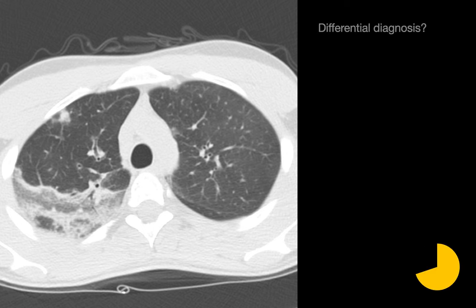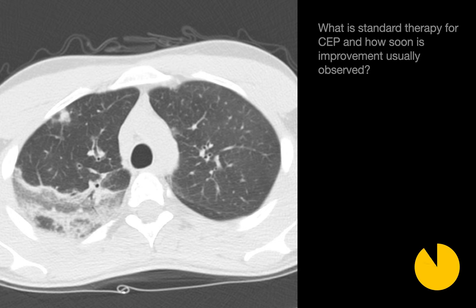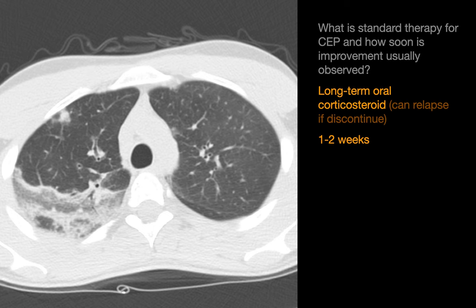What's your differential diagnosis for this case? We are presented with a focal lung opacity consisting of ground glass opacities and a few bands of consolidation. Ground glass opacities that don't appear in isolation are non-specific, so the differential is better based off the bands of consolidation, giving us this list. Since ground glass opacities are present, one of the seven items on this list is excluded. This case is an example of chronic eosinophilic pneumonia. Standard therapy for CEP is long-term oral corticosteroids, and improvement can usually be observed within one to two weeks after initiation of treatment.